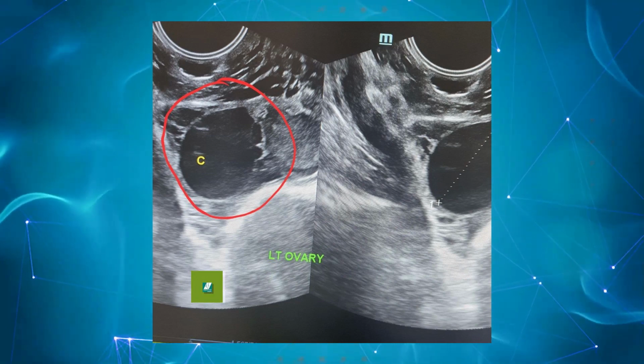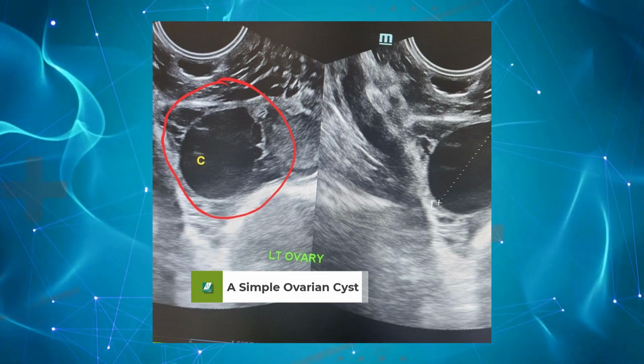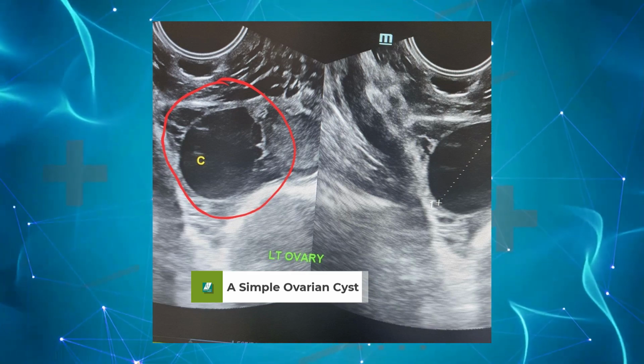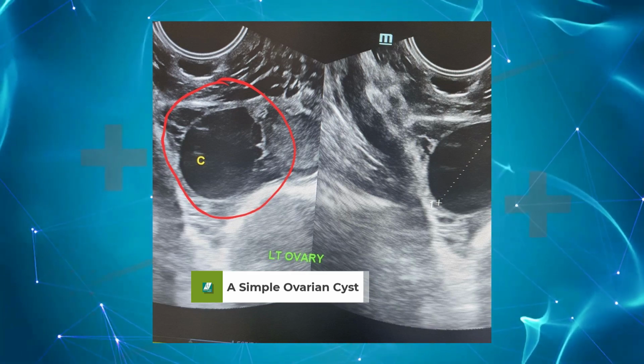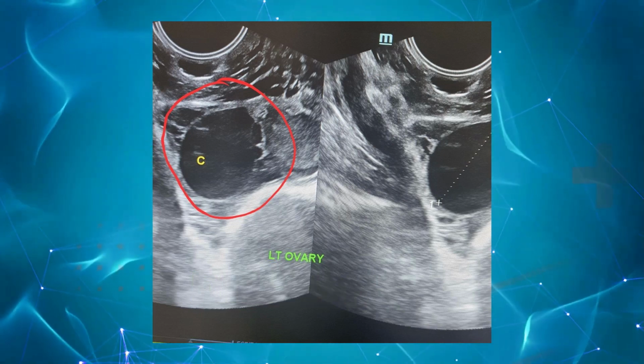Sometimes you'll also want to look at the components inside the cyst. Are there any other components like echogenic lesions, like septations? We should be able to look at them. If they're there, then we'll be able to categorize the cyst as simple or complex, so that we can communicate this to the team of clinicians and doctors who are attending to you at the hospital.